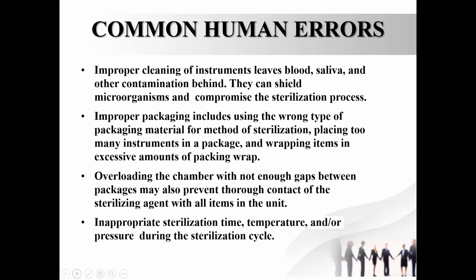Second, improper packaging, like wrong type of packaging material. I talked about a box with no holes. It can never become sterile inside. Okay? Or placing too many instruments in a package, or wrapping the items in an excessive amount of packing wrap. Take a very large wrap like a bed sheet or a draw sheet and pack a small packet. So you will have several layers of packing material outside that pack, so the steam cannot go inside in the holding time selected. Okay, so wrong packing is second.